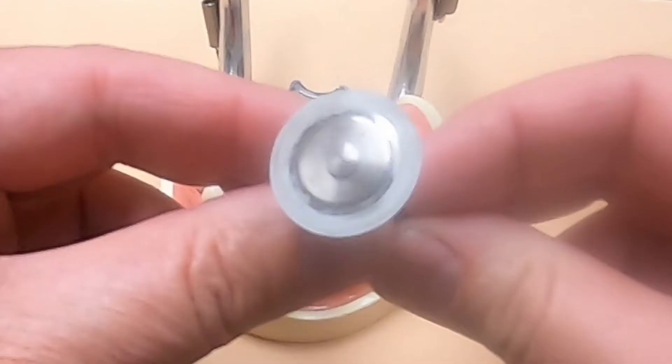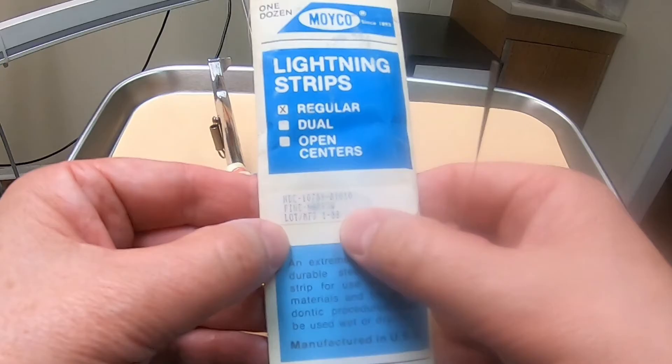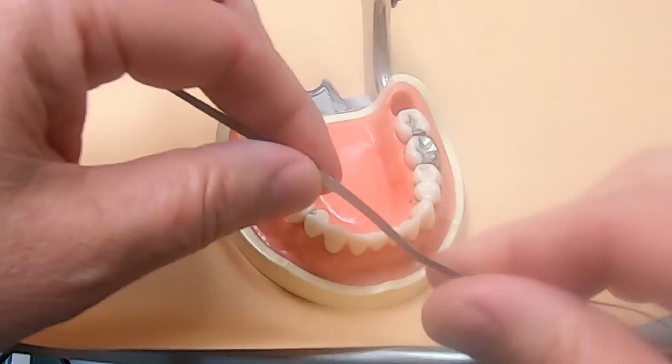I trimmed my teeth using two different tools. One is a diamond disc, used in a dental handpiece that's similar to a dremel tool — this is a quick way to make some room in between two teeth. The other tool I used is a diamond strip, which is basically a metal sandpaper strip that slowly trims down the teeth.